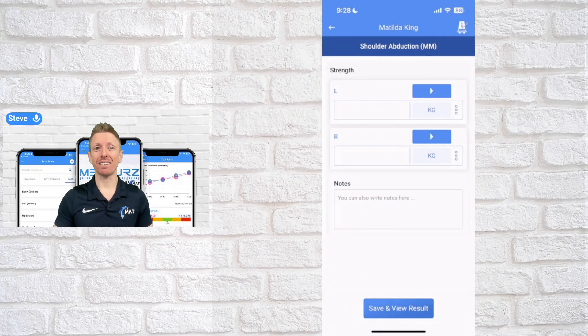This section is about how the muscle meter integrates with the measures app. It's a really quick, simple way to get great isometric strength data utilising the muscle meter.